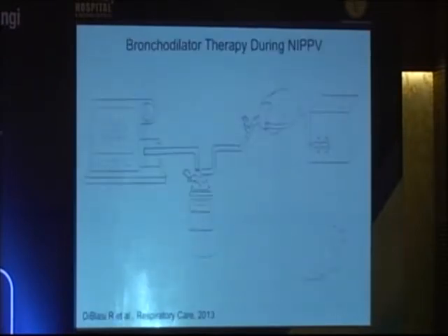What about non-invasive ventilation? Have you ever wondered, I want to do mask ventilation with this child and hopefully try to avoid the need for invasive mechanical ventilation? Some of you may have BiPAP, or you use your current mechanical ventilators, as most of the ventilators nowadays have a non-invasive mode. The Servo-I ventilator, the Avia ventilator, all those ventilators you can set up, and rather than using an endotracheal tube, you can place a face mask, and there seems to be a lot of interest in doing that nowadays, especially in your asthmatics. We don't have many asthmatics that are intubated any longer.